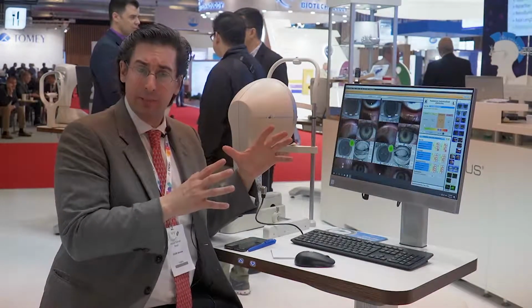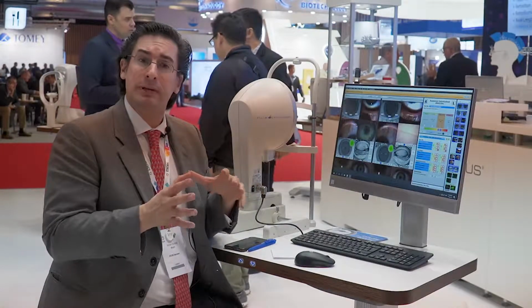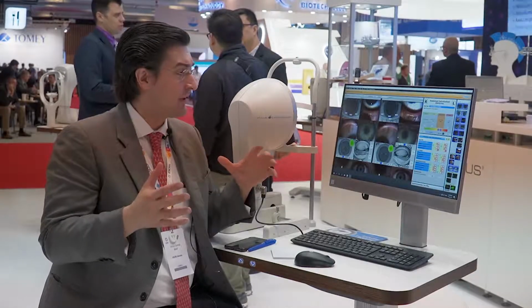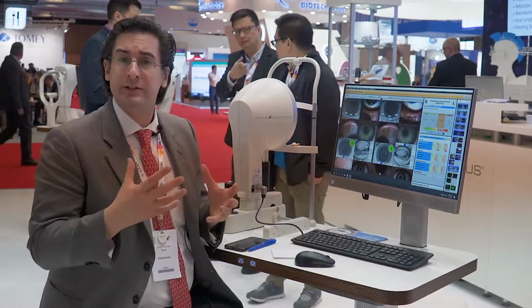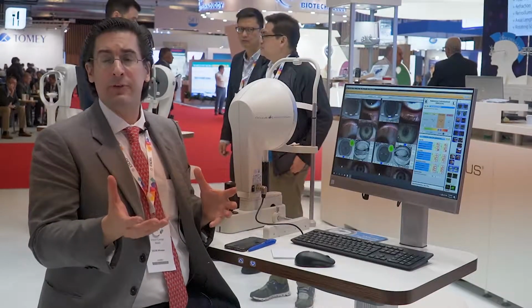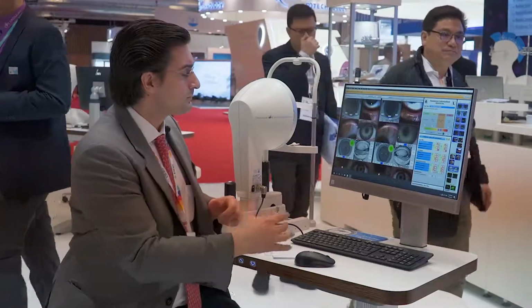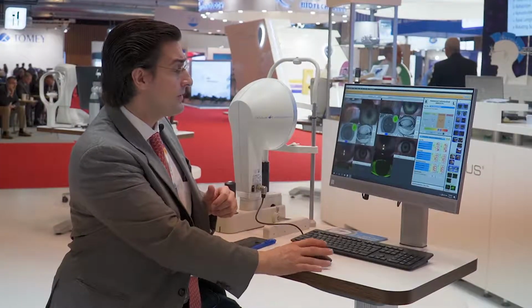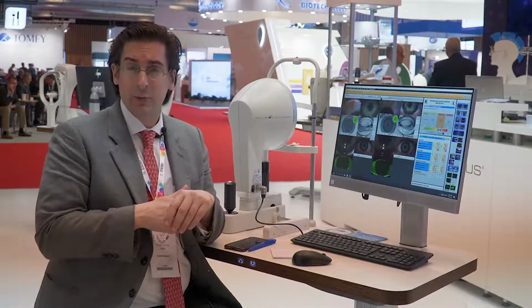Another very interesting exam is the redness. So you can take the picture and quantify the redness of the eye. This is not only good for dry eye, but for other inflammatory diseases. All this you can put in a graph and score it to the patient, make him believe he has dry eye, and if he has, get better after the treatment. And this is very important with the new treatments like IPL and gland expression that we have today.